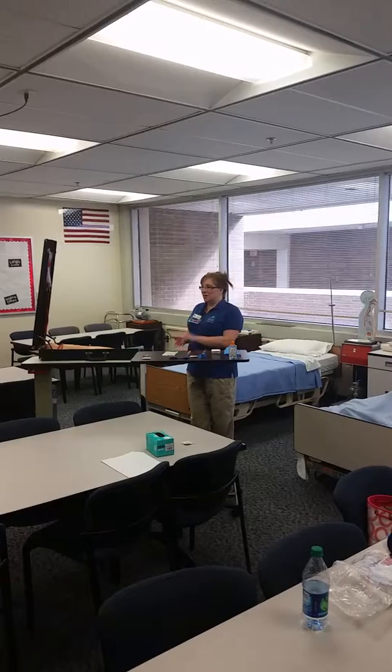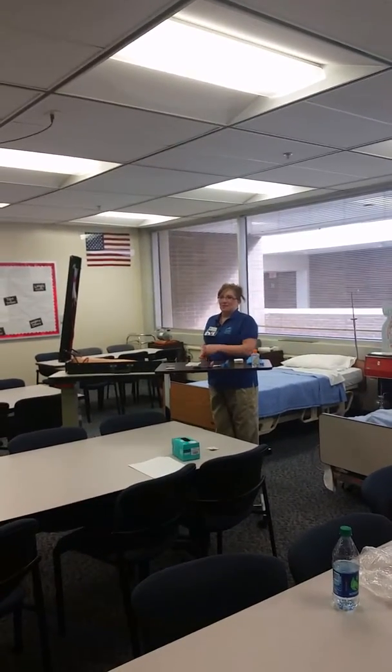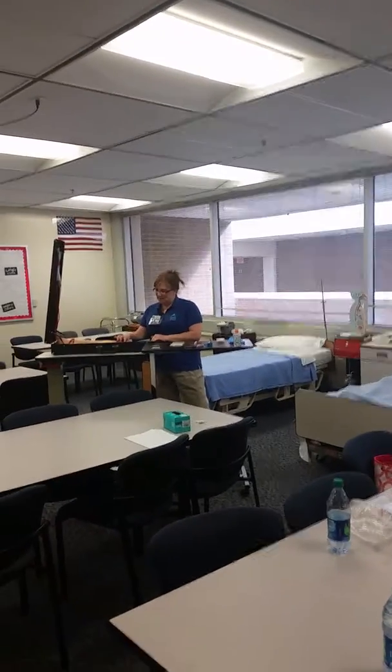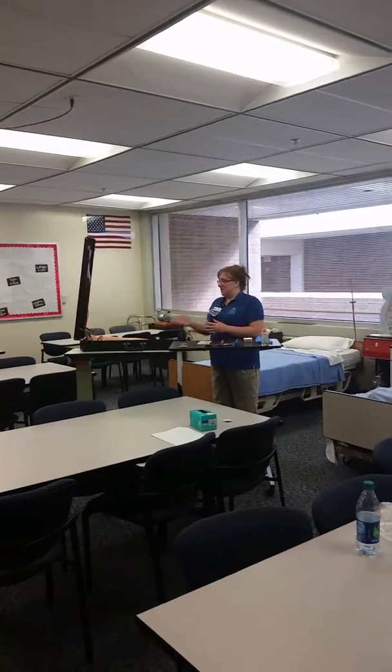First, I would check the MAR for the doctor's orders, and I'd gather all my supplies. Come into the patient's room, do hand hygiene, identify the patient using two forms of ID, name and date of birth, checking it against their armband, and ask the patient if they have any allergies. I would explain the procedure to the patient to make sure they're familiar with it.